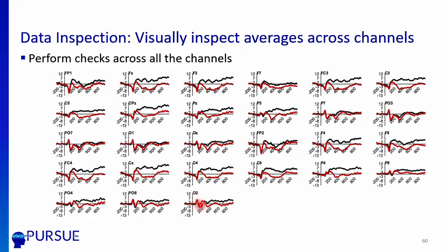You can look at your occipital electrodes to see, do you have a signal which is related to visually presenting the stimuli, since all of our studies are visual presentations. And is that clearly marked in the ERPs? That is, are we getting signal? That's the first question I ask. And then the next question I ask when looking at these is, is there any drift or big ugly signal that looks like some kind of artifact that still remains in the data? If so, we might want to go back and look at it.